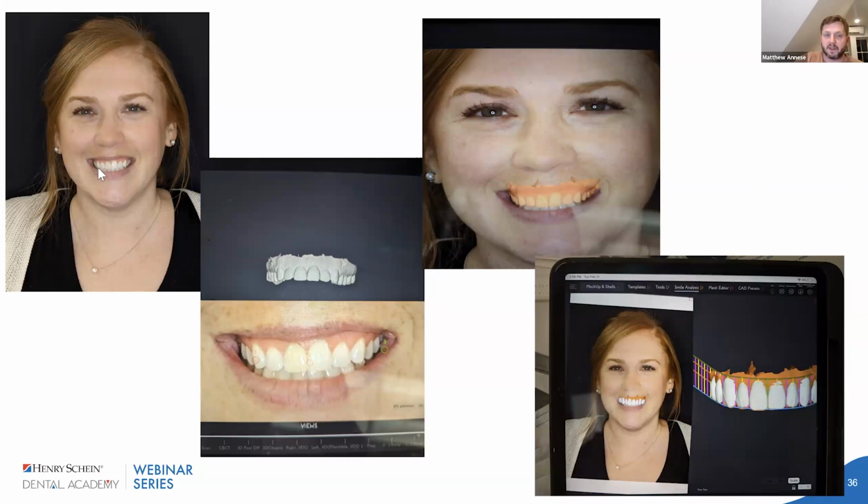I think this is where these applications come in really handy, especially if you don't have the full dedicated built-up laptop, where you'd be relying more on exocad, ExoPlan, and Smile Designer. I would look heavily into DSD or SmileFi, which are both seamless applications with an iPad. It's pretty cool that you can just bring in the STL files. They have their own apps. These are the digital scans, and then you're designing based on 3D mockups.